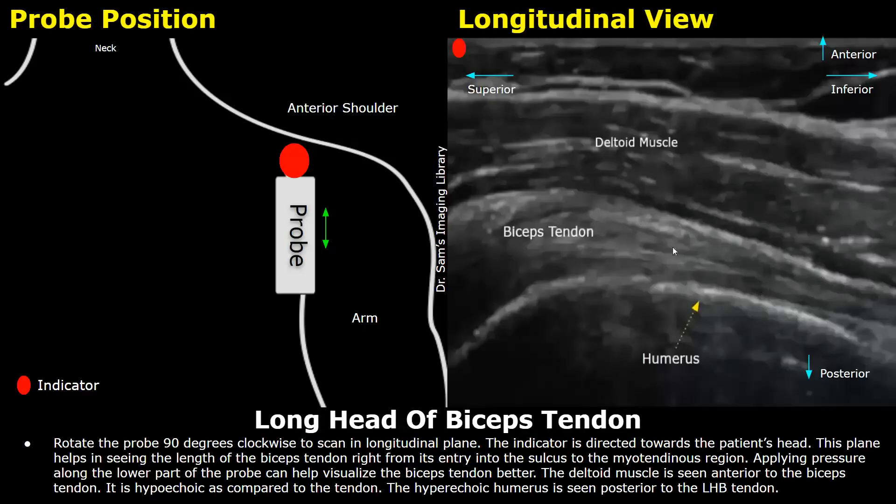Applying pressure will remove anisotropy — an artifact due to which some hypoechoic areas are seen inside the tendon. These areas may resemble tears, leading to an inaccurate diagnosis. So apply pressure and angle the probe to keep it perpendicular to the tendon, and you will get the best visualization. The tendon appears hyperechoic as compared to the deltoid muscle in the longitudinal view.